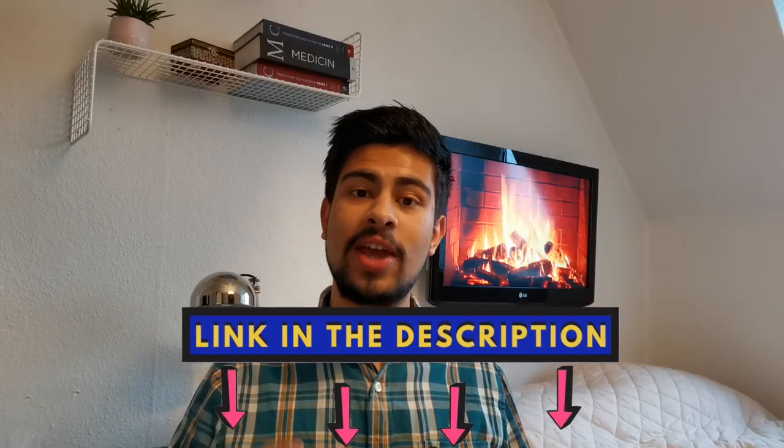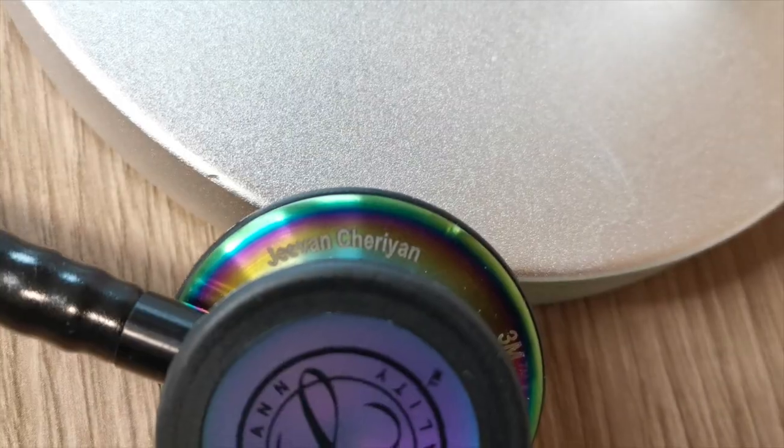When you order through this website you can actually engrave onto the chest piece of the stethoscope, just like I've done here. As you can see, I've put my full name on it and I think it's a really cool feature — it makes your stethoscope more personal. Also, apparently stethoscopes can go missing in the hospital, so if you have your name on it, nobody's going to touch it.